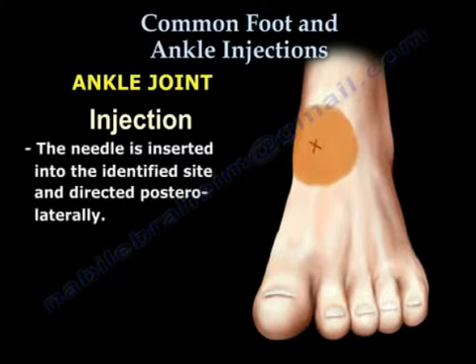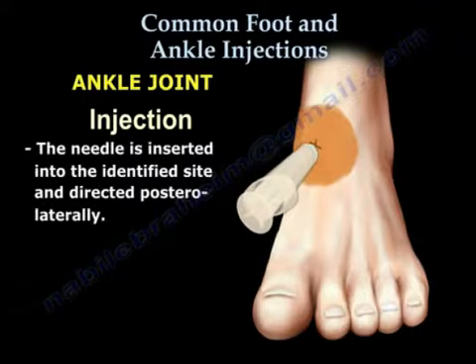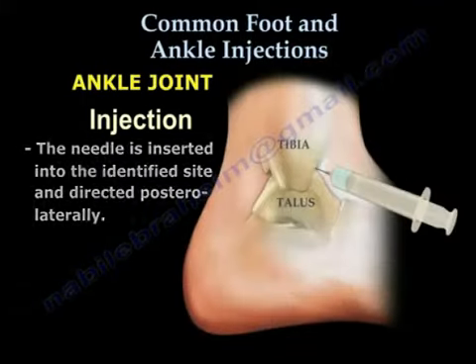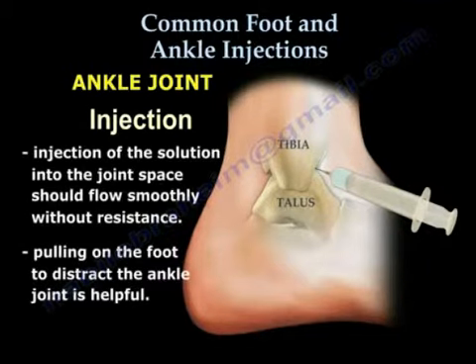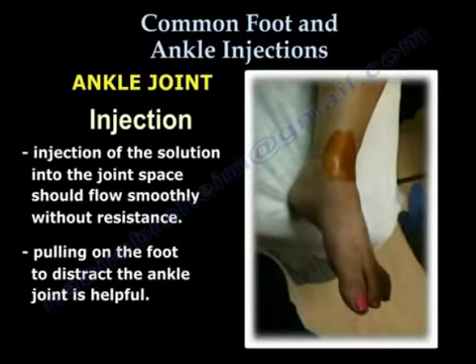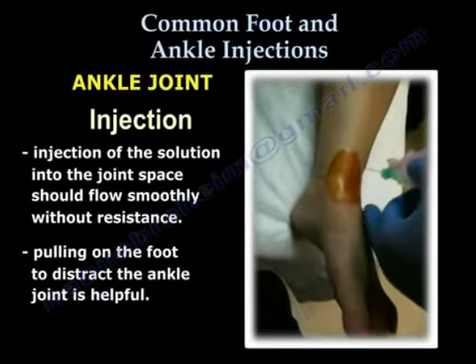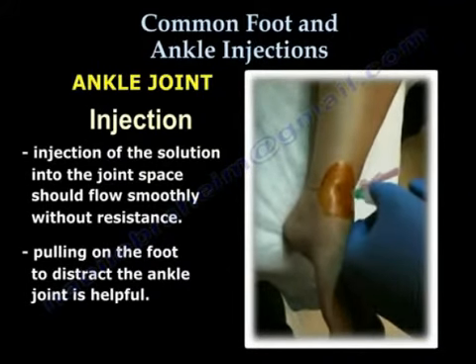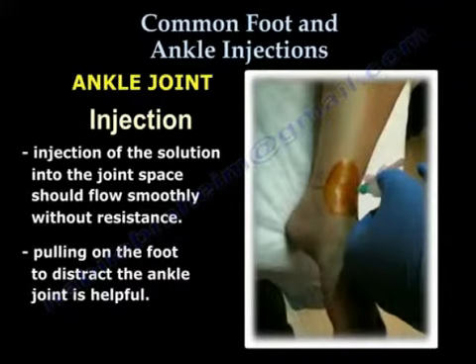The needle is inserted into the identified site and directed posterolaterally. Pulling on the foot to distract the ankle joint is helpful. It will facilitate injection of the solution into the joint space and will allow the fluid to flow smoothly without resistance.